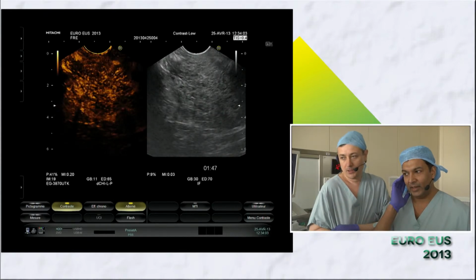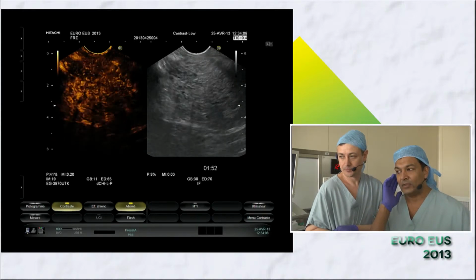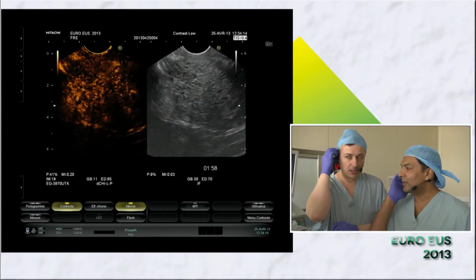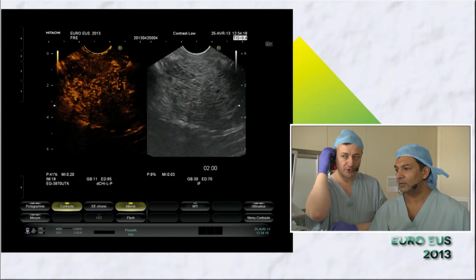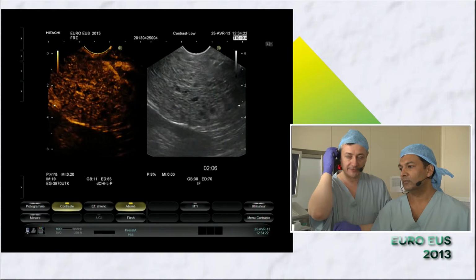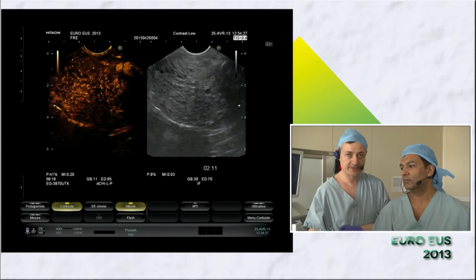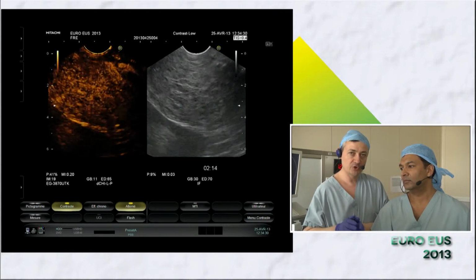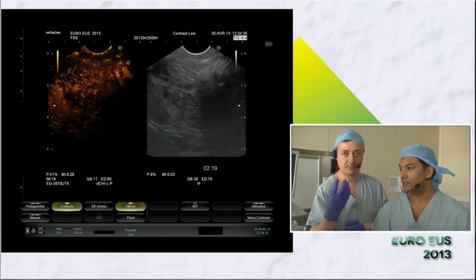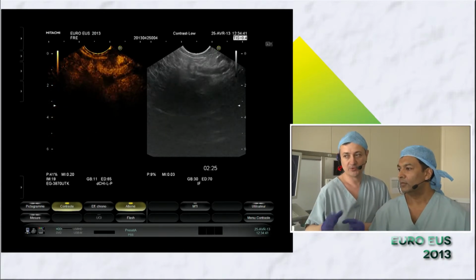It's always a possibility, but to me, just looking at it macroscopically, without the contrast, it looks too microcystic to be a neuroendocrine tumor. But then the contrast also helps, I imagine? Yeah, most neuroendocrine tumors are hypervascular, but they usually wash out in the late venous phase. What you see now is that the contrast is still there. We are almost at 2 minutes. Malignant neuroendocrine tumors especially wash out pretty fast. They have a burst in the arterial phase, and then in the venous phase they usually wash out. So that's one of the criteria.